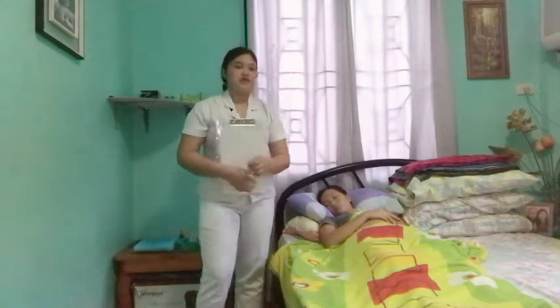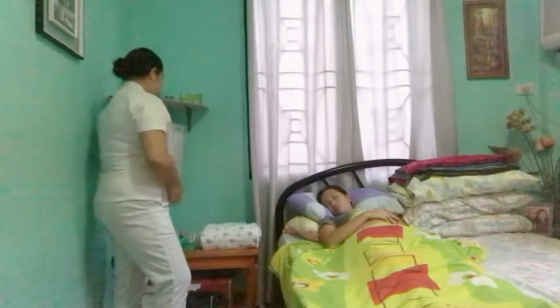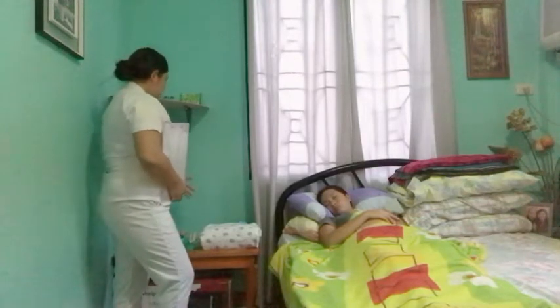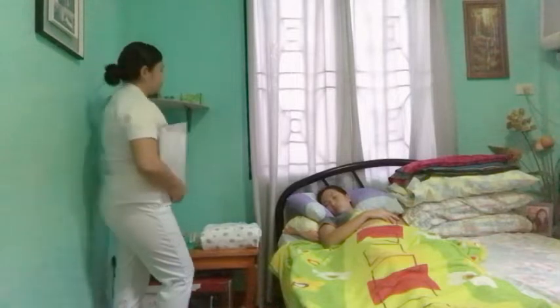And for today's demonstration, I will be performing the female urinary catheterization, which allows urine to drain if you have any obstruction in the tube that carries urine out of the bladder. So I have here the equipment that I will be going to use: the set of catheter, kidney basin and scissors, lubricant, catheterization and a tape, sterile water, antiseptic solution, and waterproof underpad.